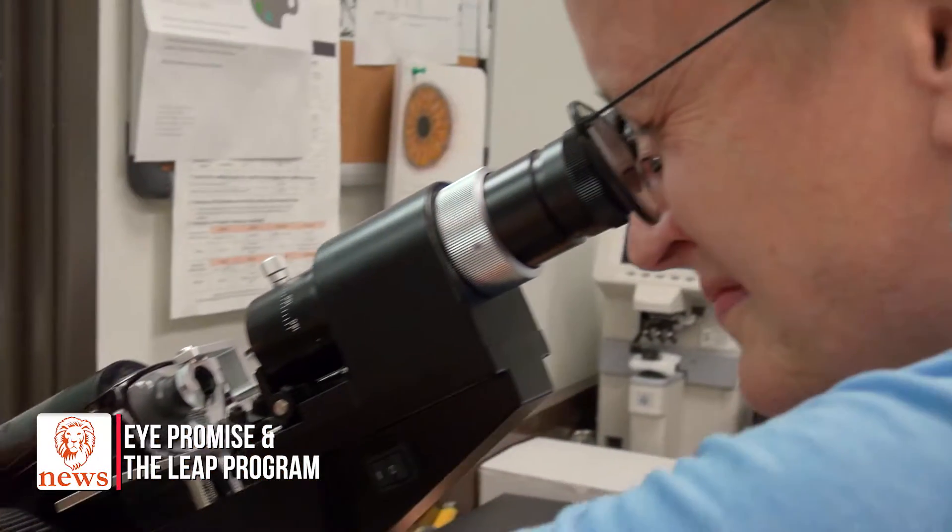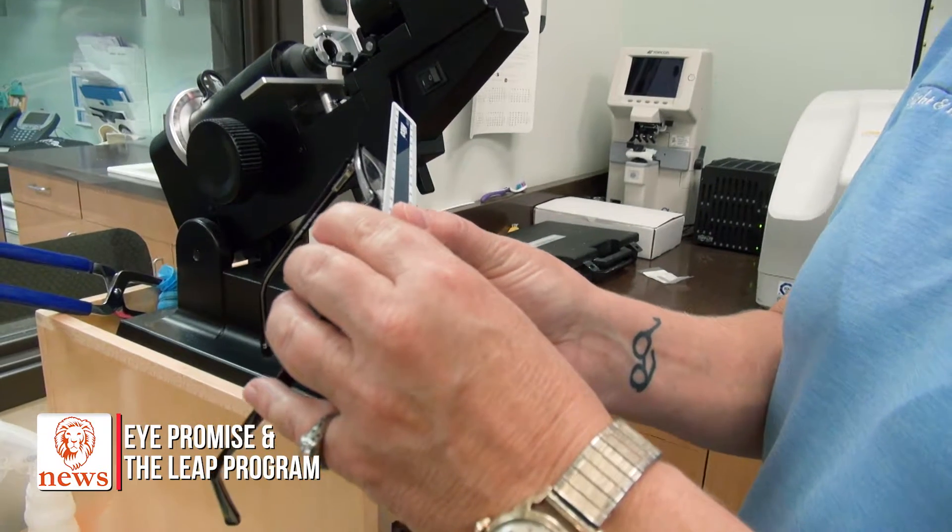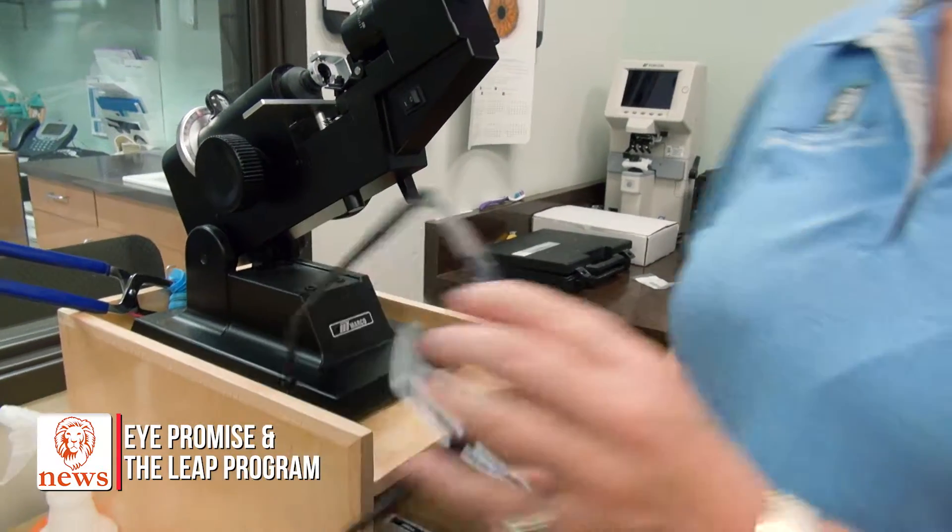Everything checked out in the lensometer. Now I'm going to make sure the PD is dead on — and we check. Yep, it said 60. I love my job because I get to help so many people and work with folks who come here with a heart for helping people every day, with not only sight but hearing as well. We just love what we do here — I love working with the Lions Sight and Hearing Foundation. That's why I got this.